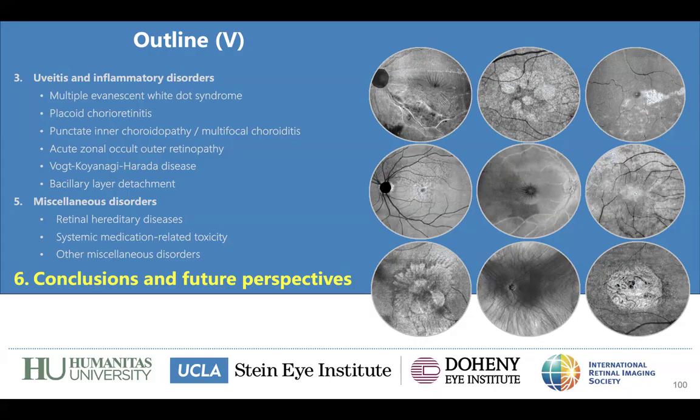Murilo is asking you to publish an OCT atlas or something. He is saying that your images are very nice, and there are some questions about software or hardware. Sorry, I don't know. We can look at this. We can conclude and then do the questions.